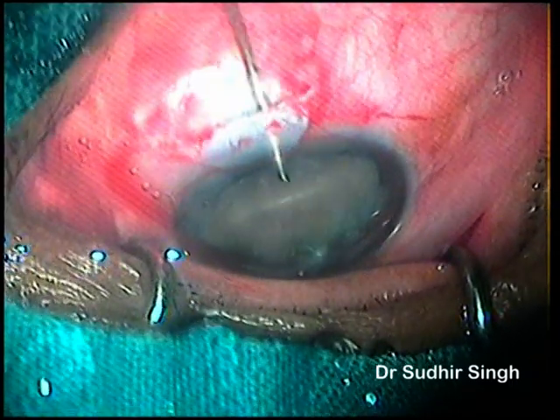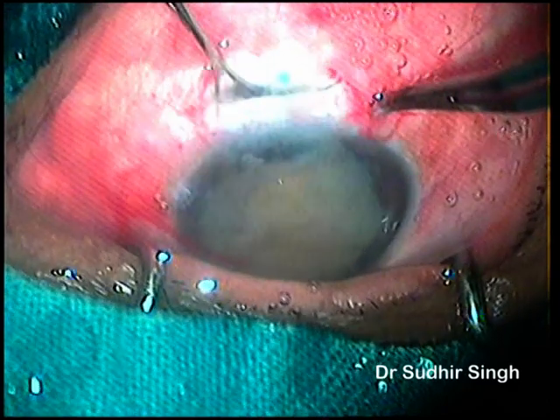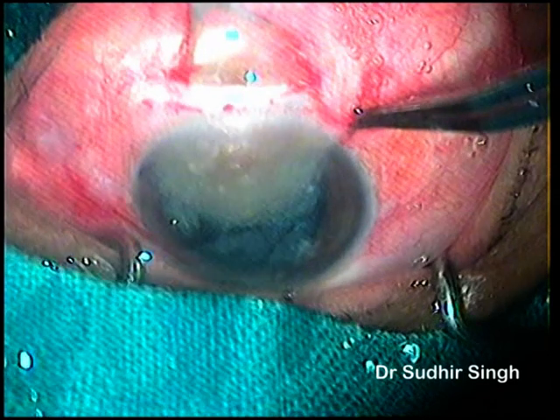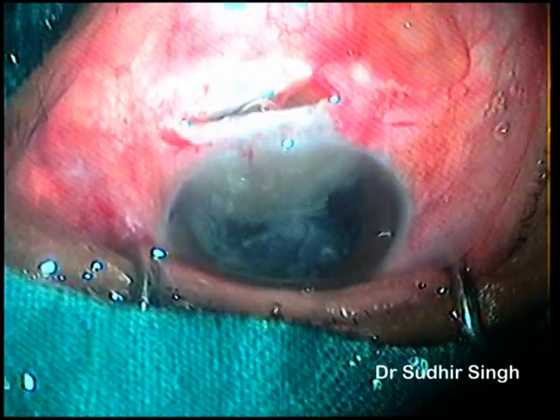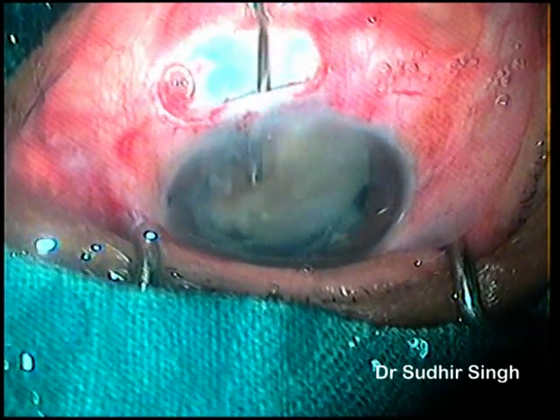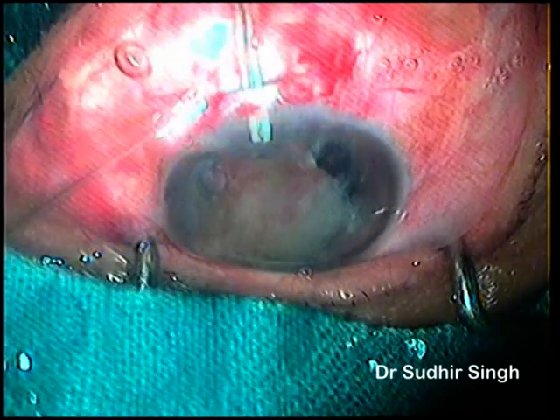Enough viscoelastics are placed in front of and behind the nucleus to keep it away from the endothelium and iris. The vectus is introduced into the anterior chamber and the nucleus is taken into its loop, then pulled straight posteriorly by pressing the floor of the tunnel. When the nucleus is entangled in the tunnel, the vectus is pulled up and posteriorly, causing nucleus fracture inside the tunnel.